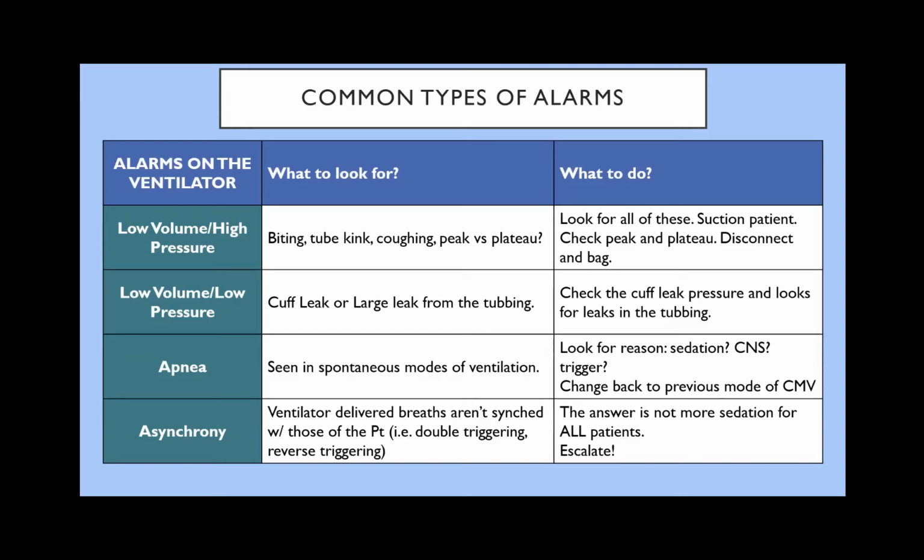And after you did all of that, if the pressures are still high, then you can ask for help to figure out what is the next step.